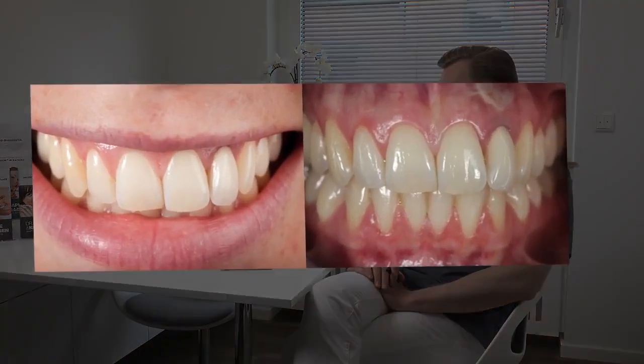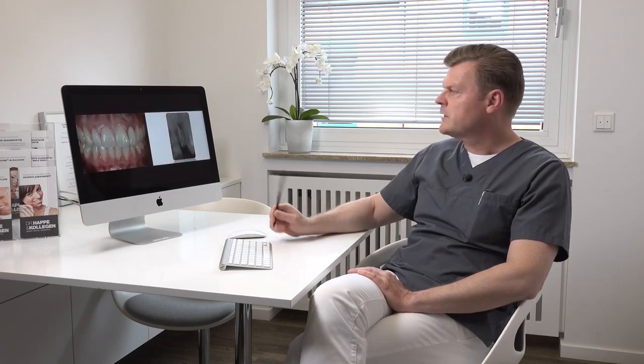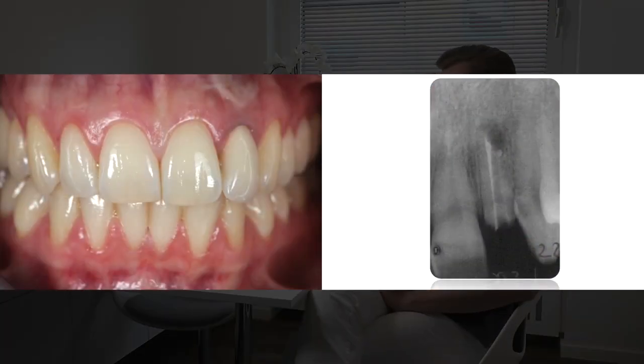I would like to show you a case of a patient. It's a 30-year-old woman that presented in the office with a failing lateral incisor in the anterior region. You can see on the picture it's the left lateral incisor, and on the x-ray you see a failing root. We were not able to restore this root anymore with a crown, so we planned to take it out and in the same session place an immediate implant.